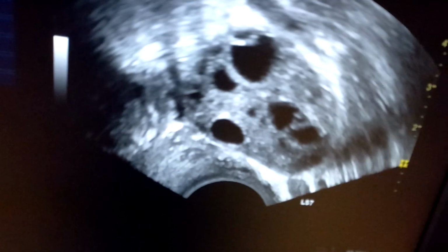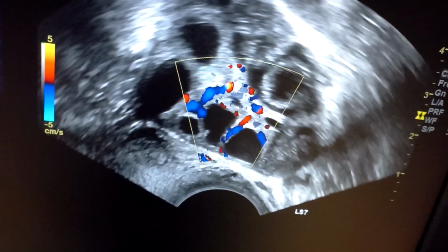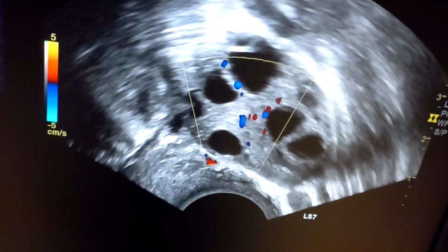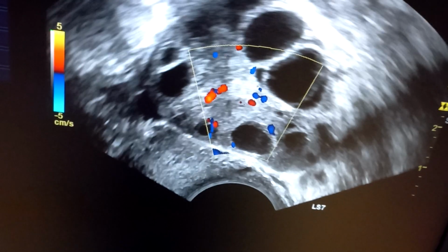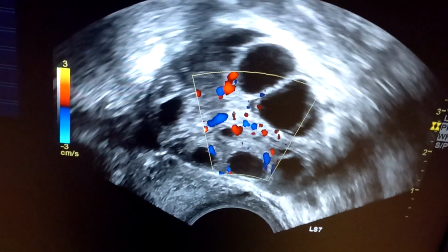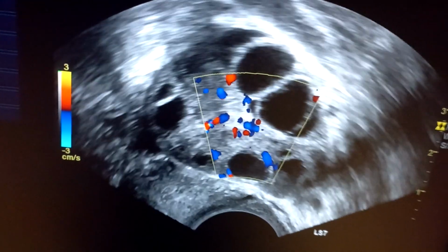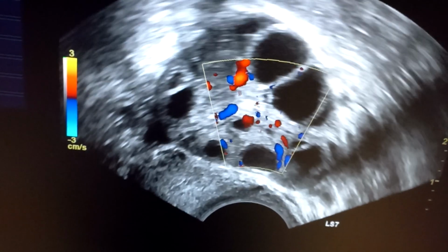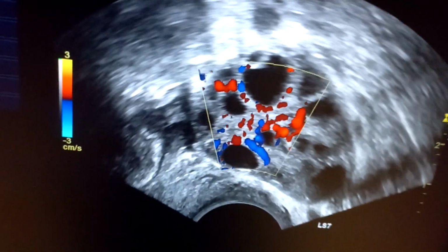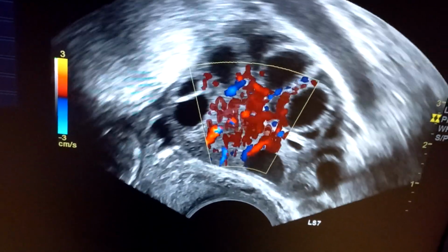The way to get such a beautiful even cohort is to pre-medicate the patient very well. So we have treated this patient for a good 15 days to a month prior to going ahead with the stimulation, and you can make out over here that the blood supply of the ovary and of the follicles is quite good. This is a rough estimate that tells us that this ovary is going to generate a good number of M2 oocytes, which we can use for IVF.